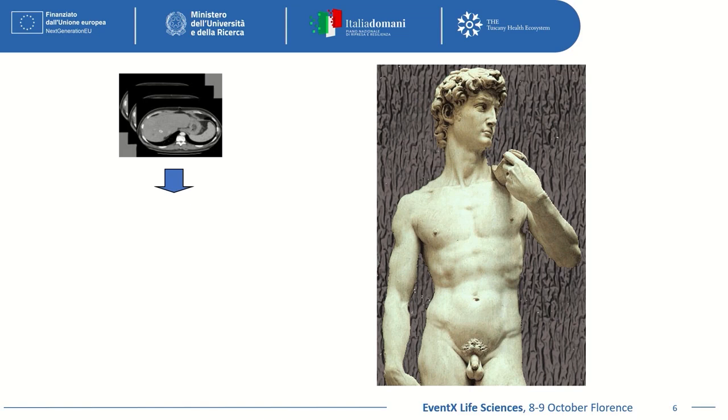Okay, in 2019, with my group, we obtained this kind of guidance directly in the surgical room, showing in front of the user the planned trajectory to follow with the surgical scalpel, and unfortunately, the video does not work.